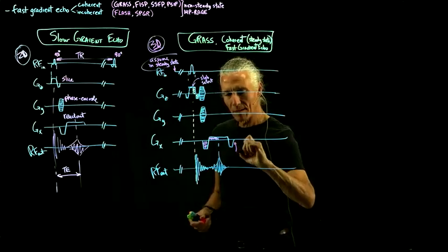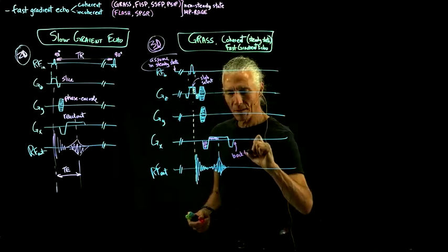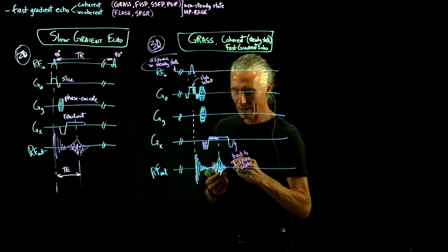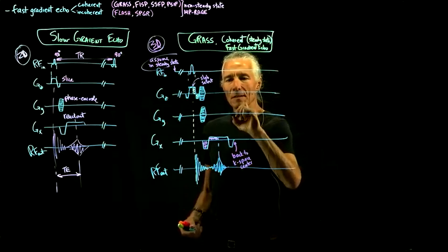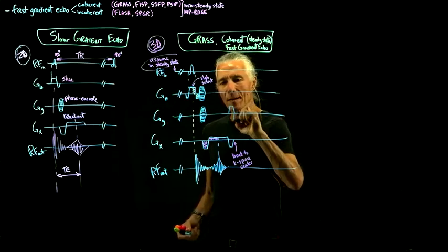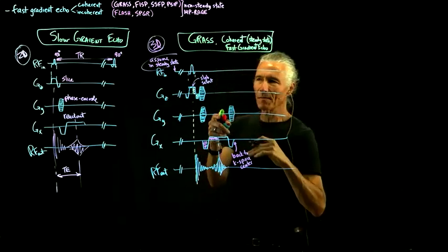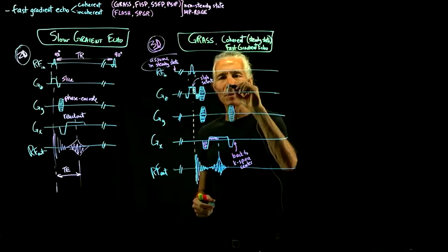So back to k-space center. And then we just do the same thing with the other gradients. So I just patch everything back up again with the other gradients, because this one will put us off from the k-space center in the y direction, and this one would have put us off from the k-space center in the z direction.